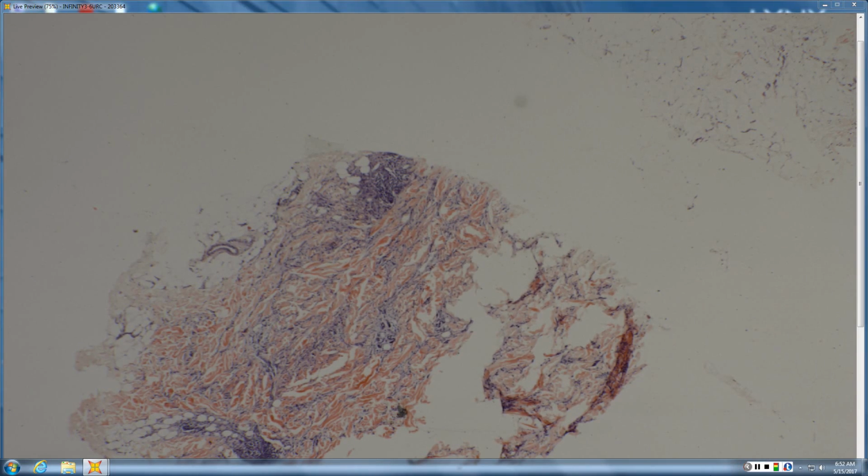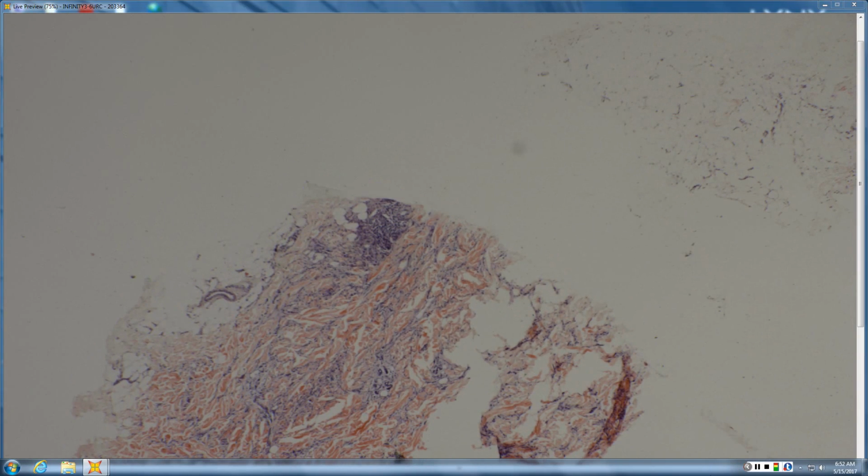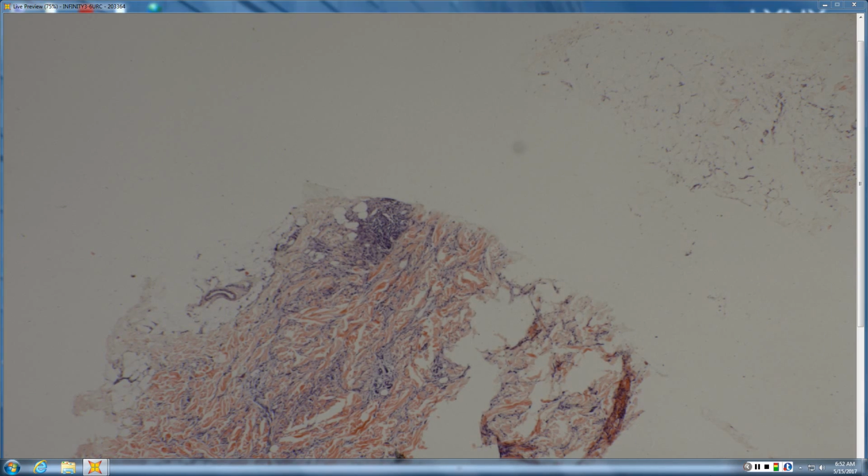Hopefully from scan you'd pick up that, unlike just an interstitial fibroblastic proliferation with mucin but otherwise bland appearing, even from 2x you can see jet black, hyperchromatic, larger atypical cells that are even larger than these little collections of lymphocytes.